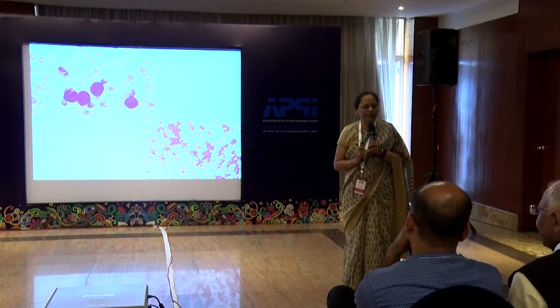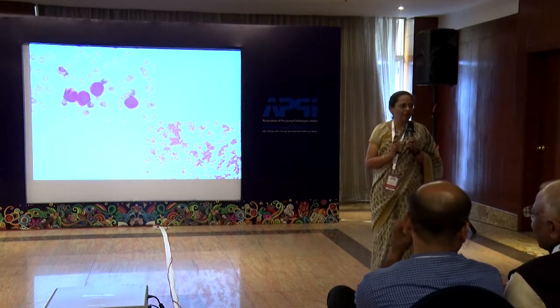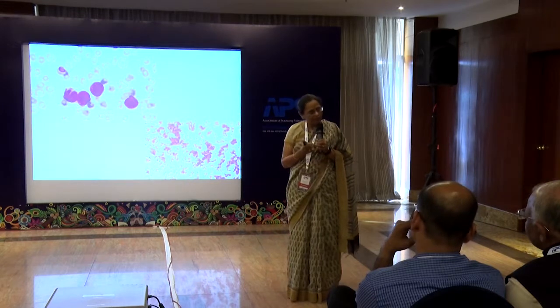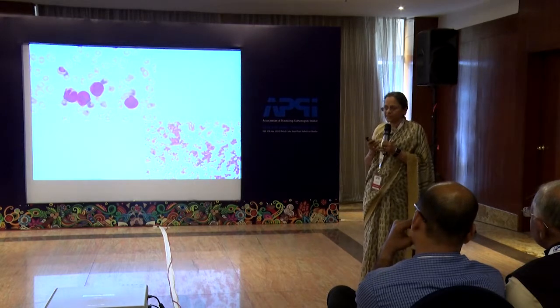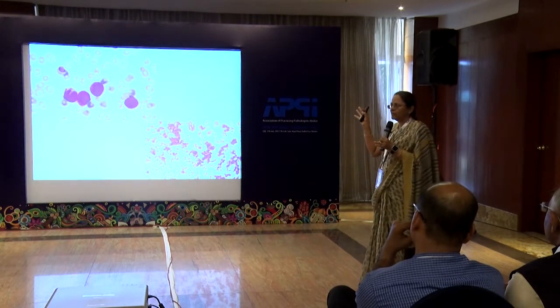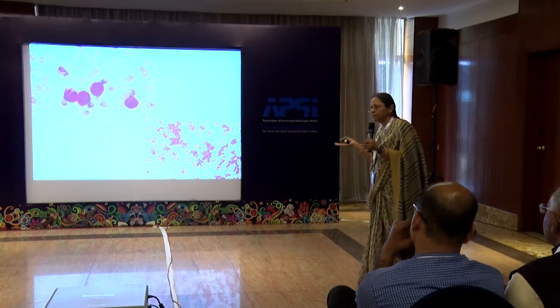There are some diagnoses that, irrespective of the level of laboratory we are practicing at, we should not miss at all. We must train our eyes. One is malaria, especially falciparum malaria. You can save a patient from death, and you can definitely save the patient from a lot of unnecessary investigation. I personally have seen many patients having LP, CT scan, MRI done, and it's falciparum malaria.